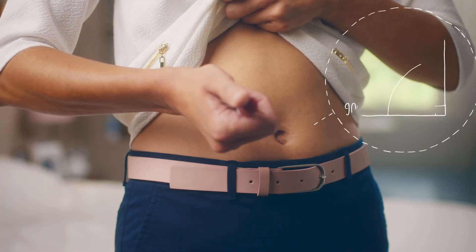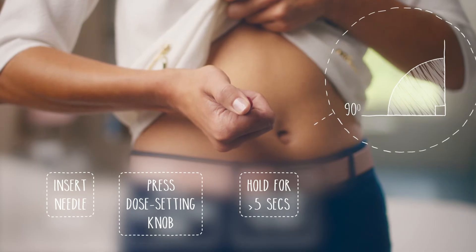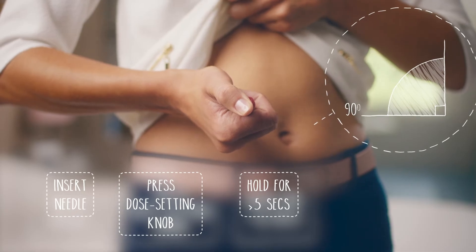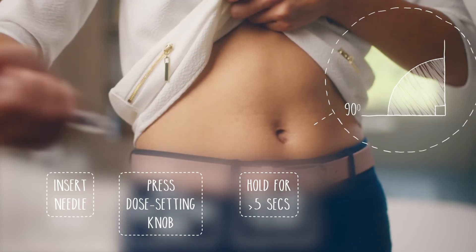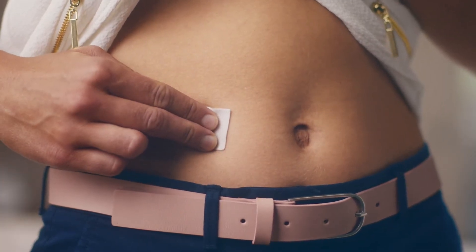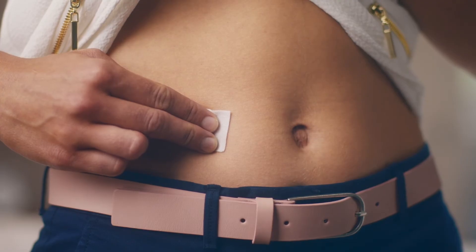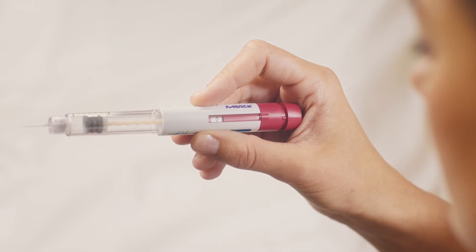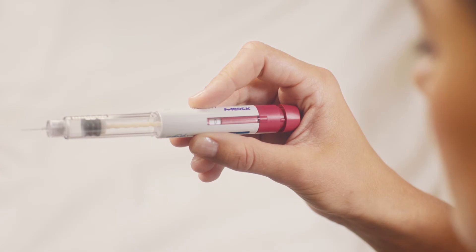There we go, it's in — just like that. When you've inserted the needle, just push the red dose setting knob down and keep it pressed down for at least five seconds. And when you're done, take the needle out, making sure you keep pressing the red knob down until you've taken the needle out completely. And that's it, all done. Now just press down on the site of your injection with an alcohol swab or cotton pad for a few seconds. Now you've finished your injection, you'll need to make sure that you've injected your full dose. The dose window should show zero, like mine here.